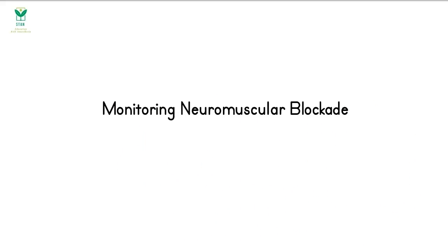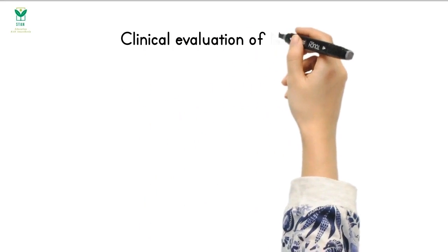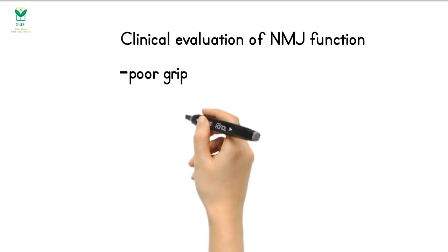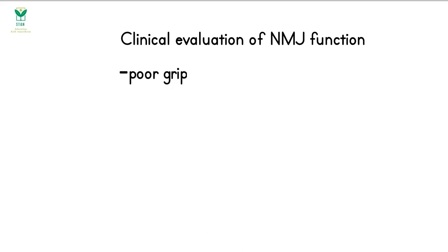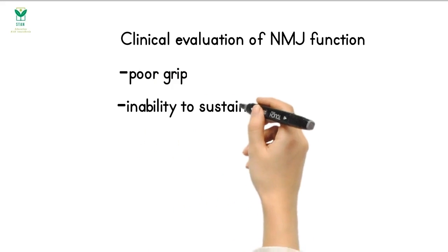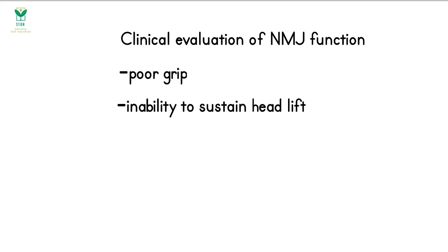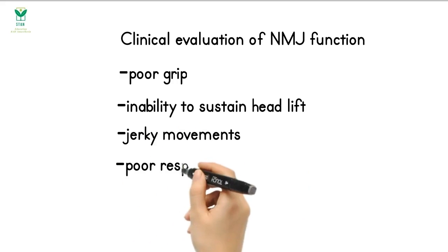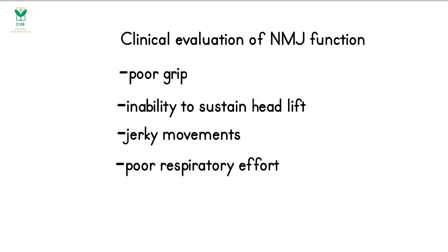Monitoring neuromuscular blockade. Following emergence from anaesthesia, inadequate reversal of neuromuscular blockade should be suspected if the patient appears weak. This may manifest as a poorly sustained grip or inability to sustain head lift, or if they display characteristic jerky movements and poor respiratory effort. Routine use of neuromuscular junction monitoring should avoid this situation.